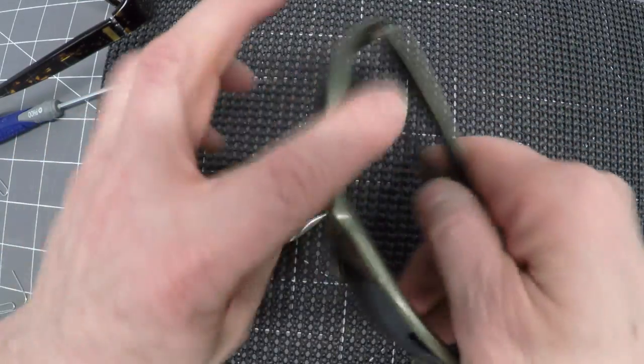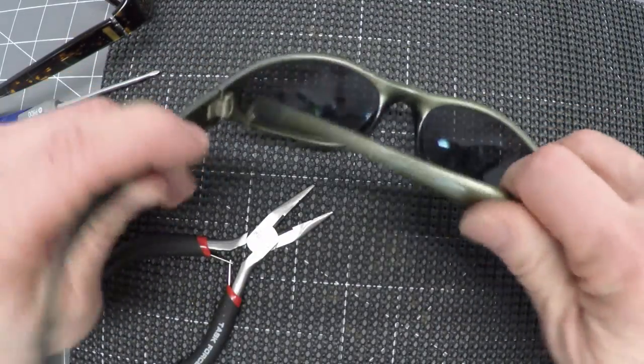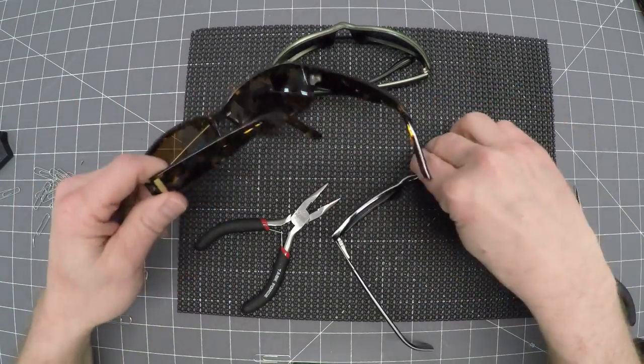I don't know, maybe this will be a trend. Maybe they'll replace all the screws with these D-clips because they will last longer than the glasses did. Saved a prescription. So there you go. Simple fixes for all sorts of glasses.